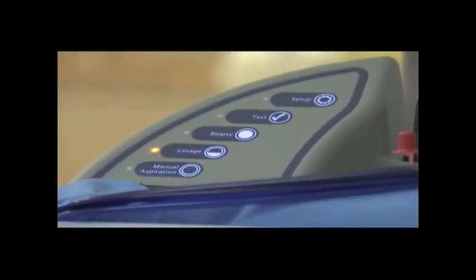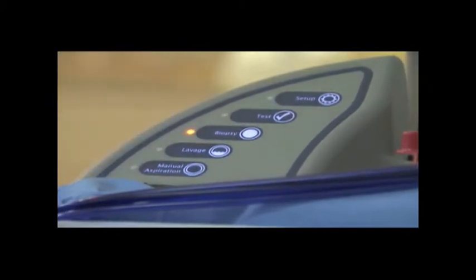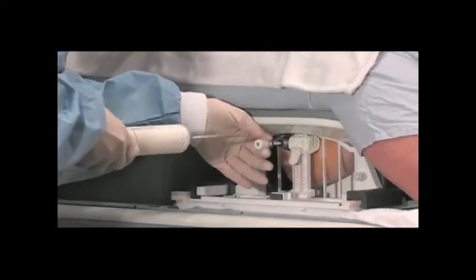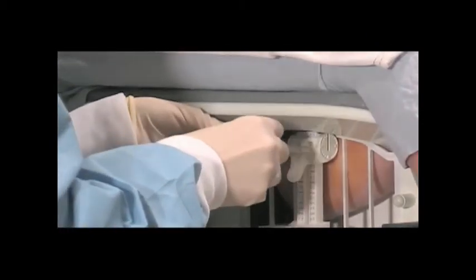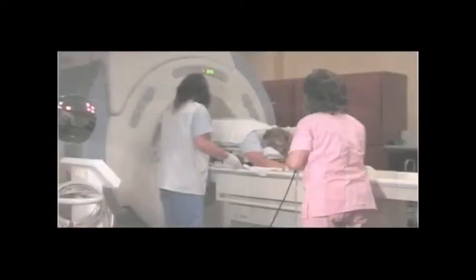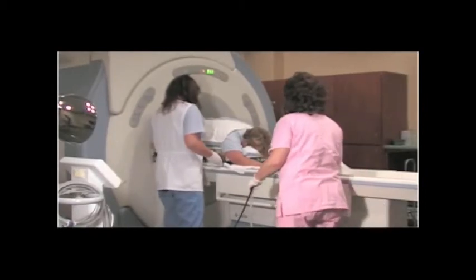Switch the console back to biopsy mode by pressing the button marked Biopsy. Remove the ATEC handpiece while leaving the introducer sheath in place. To verify the successful biopsy of the area of interest, reinsert the localizing obturator back into the introducer sheath. Move the patient back into the magnet bore to acquire post-biopsy sagittal and axial image sequences.